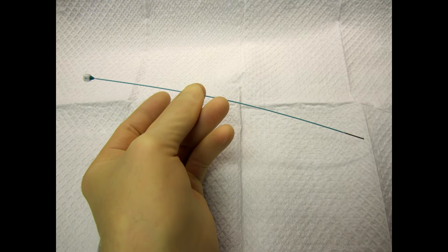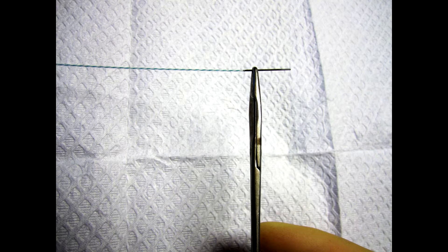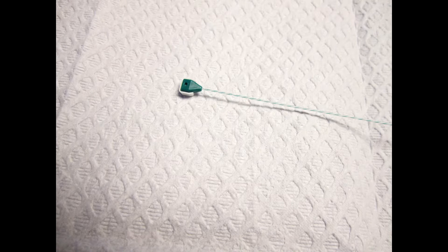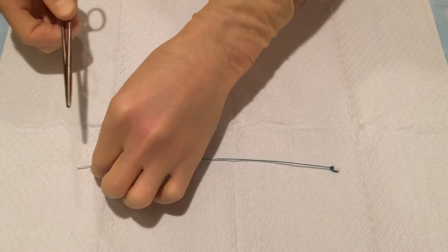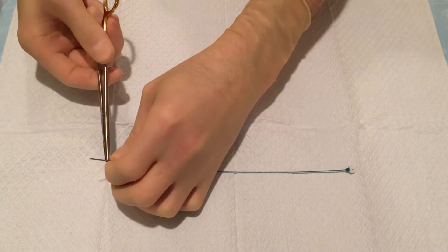The devices are long members that feature a needle at the tip and a clasp at the end. The devices can be looped upon themselves to form a secure loop as shown here. A demonstration of how the devices loop upon themselves is shown now.